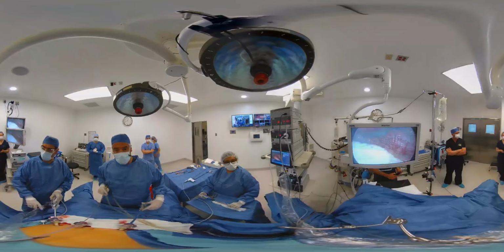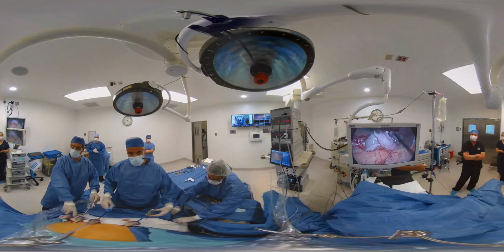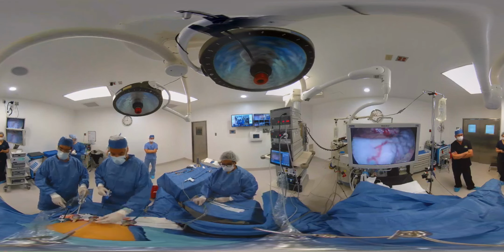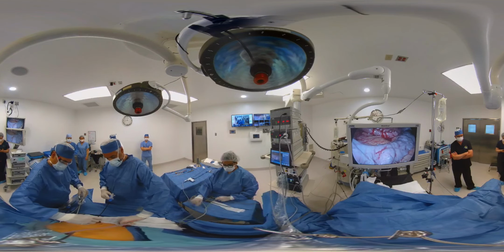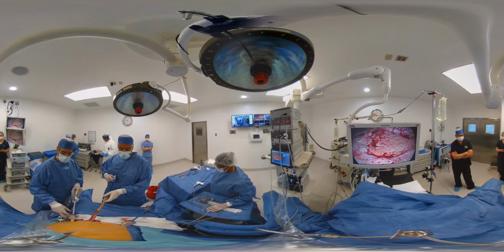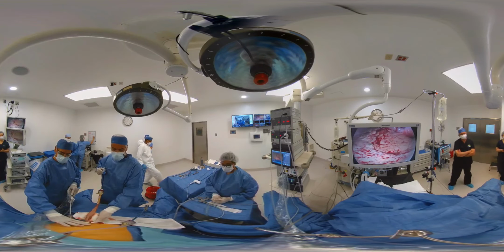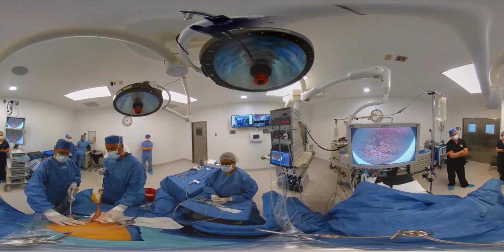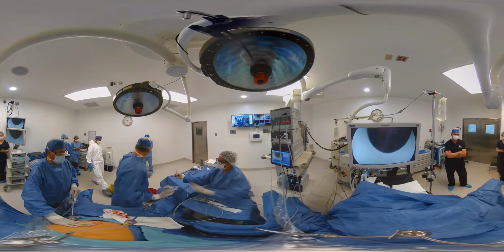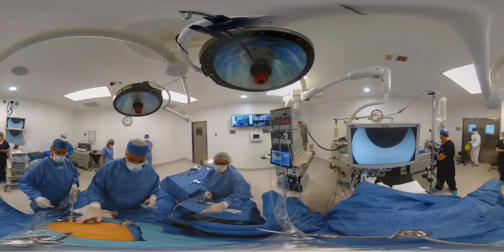So right here, you've got the end of the stomach. We're going to remove this stapled off stomach. Then we're going to inflate it for you so you can see the actual size of the stomach. So pay attention if you're looking through your goggles or your headset, or if you're on your mobile device, please look down towards the patient's belly, and you can see how we are extracting the whole stomach. Once it's completely extracted, we will pass it on. There you go. That's the rest of the stomach. And I have just passed it on to the crew, who will help us inflate it.